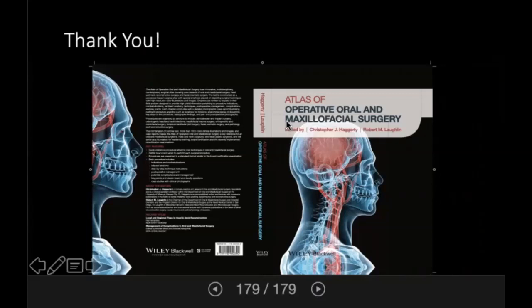Well, that's a very good question. I think that Dr. Hassan can help me out with that one a little bit. However, as we discussed, the minimum vertical restorative height for a locator is 9 millimeters. The minimum height for a hybrid is typically about 15. So what would need to happen is the prosthodontist or the restorative dentist will have to work with that patient on increasing the vertical dimension of occlusion, kind of work with getting that patient into CR. Hopefully that patient will be able to tolerate increasing it, depending on if you're doing one or two arches, an additional 5 to 10 millimeters of vertical height if they want to switch over to a fixed prosthesis.